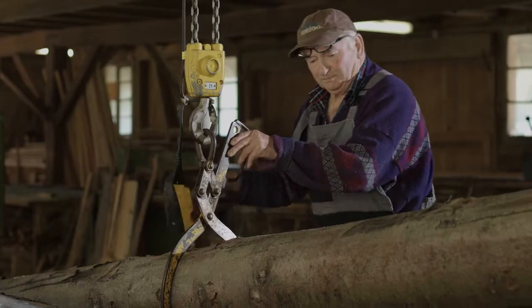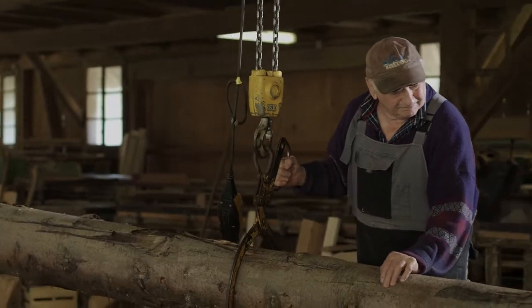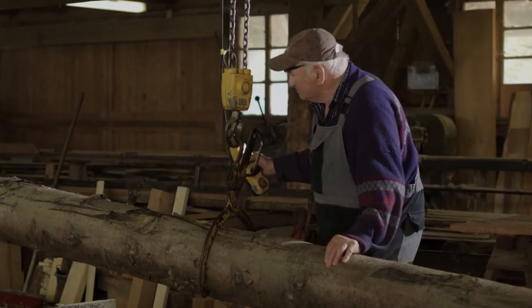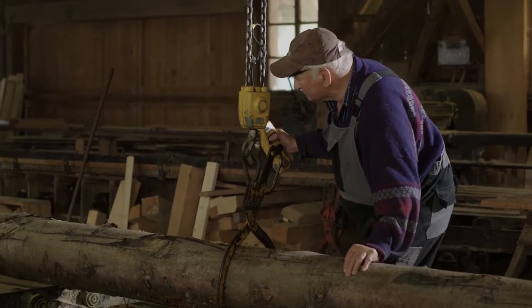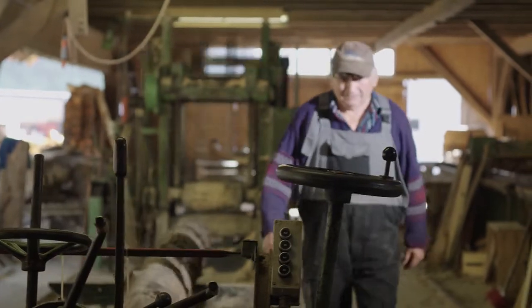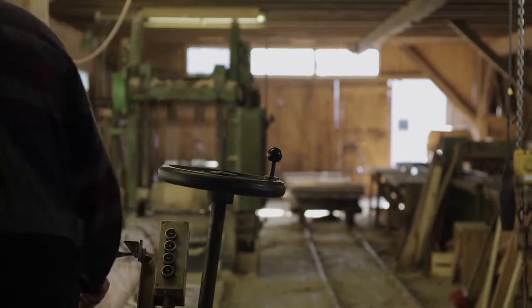Unfortunately, what works well for cutting wood does not work well for cutting bone in a live patient. Aside from the fact that wood processing machines typically produce a broader cutting width than the saw, they are invasive tools that cannot be retracted quickly or easily from the cutting medium and cannot adapt appropriately to the patient's movement.